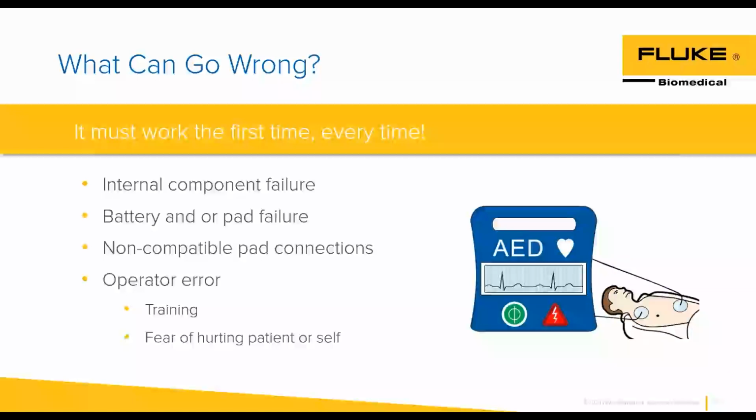I like to bring this up because as we're recording our outputs and our information from the defibrillator, everything might look okay on our paper. In our CMMS systems, are we tracking our failure codes? One of the ones that might turn up is an operator error. And this is one of those that's easy to address. We can go out and talk to people and the staff, and use our defibrillator analyzers and our simulators to show them that it's doing its job and working through it.